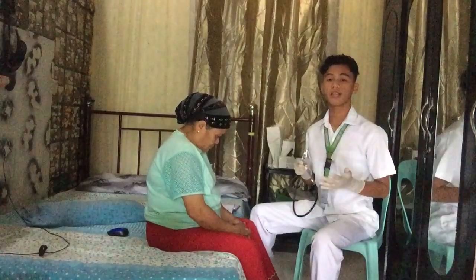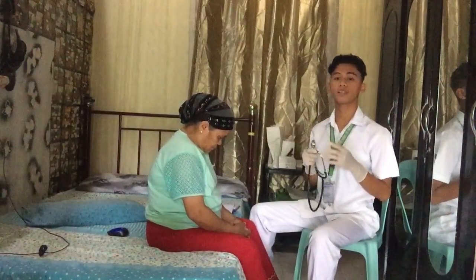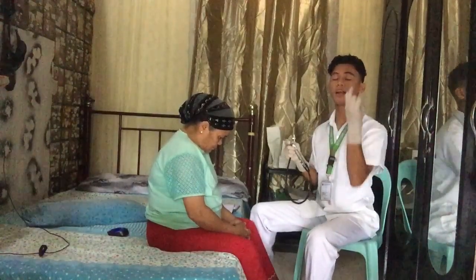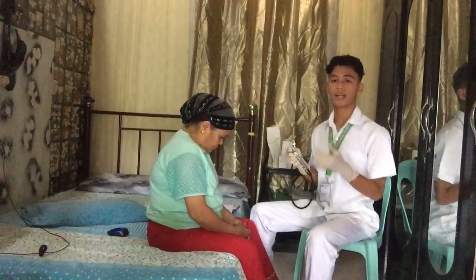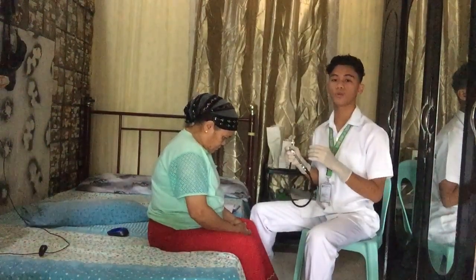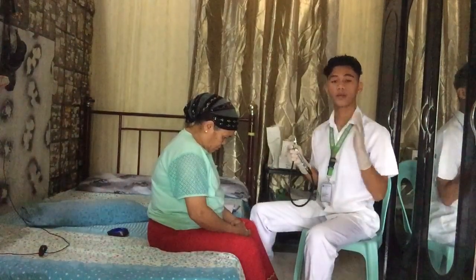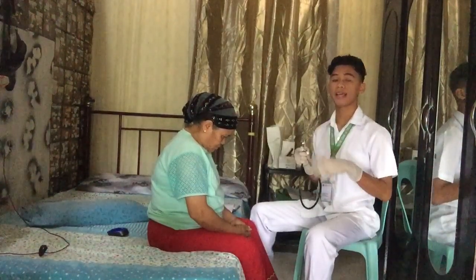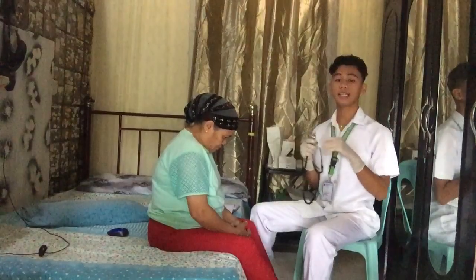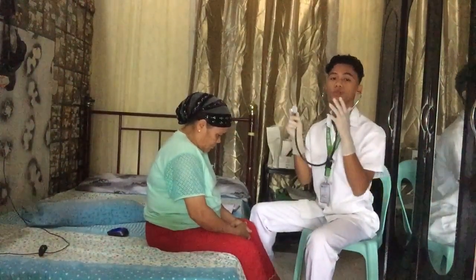So now let's proceed to the auscultation of the heart rate in all four anatomic sites, which are aortic, pulmonic, tricuspid, and mitral or apical. In every area of auscultation, distinguish both S1 and S2 sounds. Rationale: a normal beat of 60 to 100 beats per minute, and S1 and S2 must be heard in all sites. In auscultation, you are going to use the stethoscope.